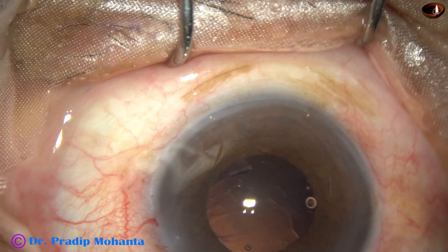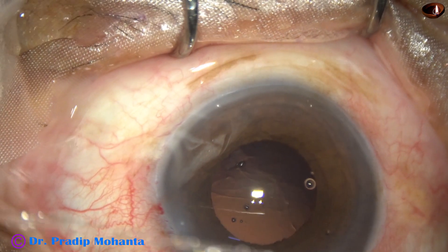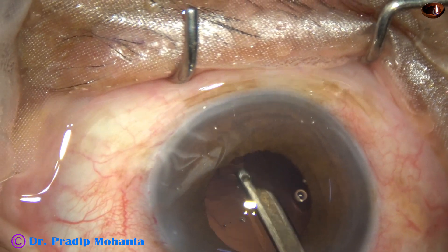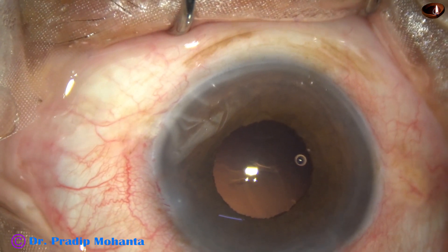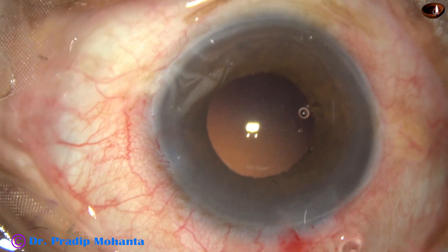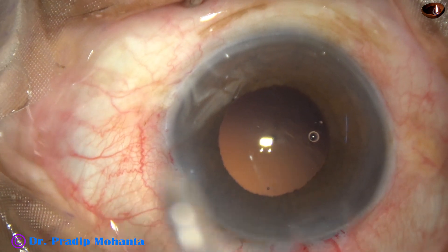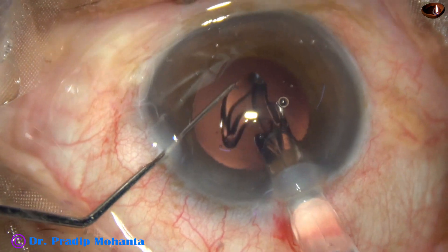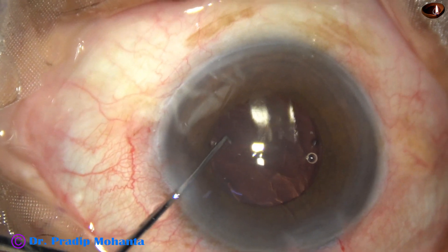Now I inject visco again judiciously, so that the iris does not prolapse out. Now is the time to implant an intraocular lens. Before that, this speck of cortex is removed. Again I inject some visco. Hydroimplantation is not a good idea in floppy iris cases, because as we try to keep the anterior chamber formed with irrigation, as soon as we open the main wound, the iris will prolapse. So, inject visco judiciously and implant an intraocular lens in the capsular bag.